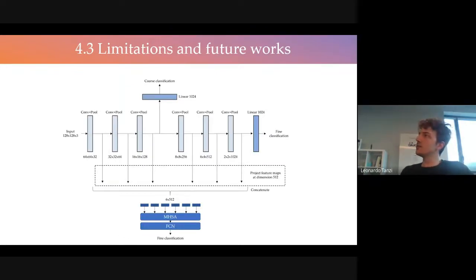Finally, this slide I was super undecided about showing to you because it could be super stupid. I still don't know. It's a very new idea. Reading a paper recently, the idea of this paper was that they presented a parallelism between the hierarchy and how a CNN works. We know that in a CNN, the first layers try to look at the most general characteristics of the images, and then they go more into particulars. And this paper presents the idea that this could be used as a parallelism with the hierarchy: at the beginning, to divide into the main classes, you look at more general characteristics, and then you switch to more particular characteristics to understand the different types of tiny fracture, for example.